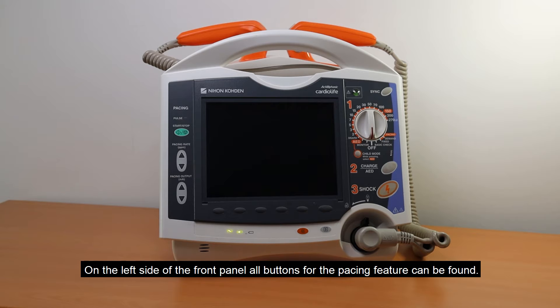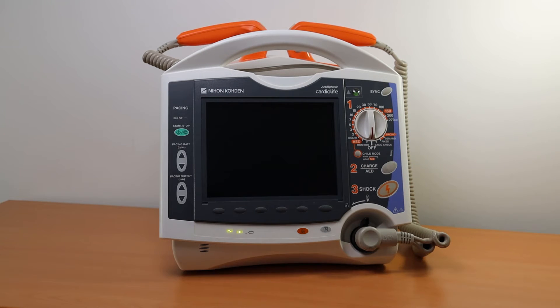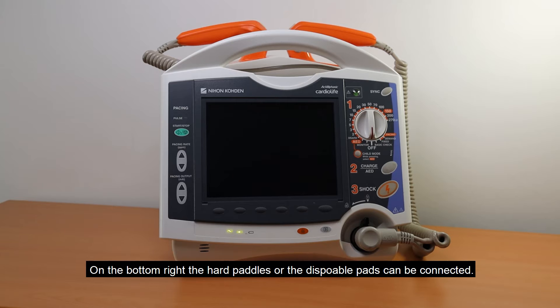On the left side of the front panel, all buttons for the pacing feature can be found. On the bottom right, the hard paddles or the disposable pads can be connected.